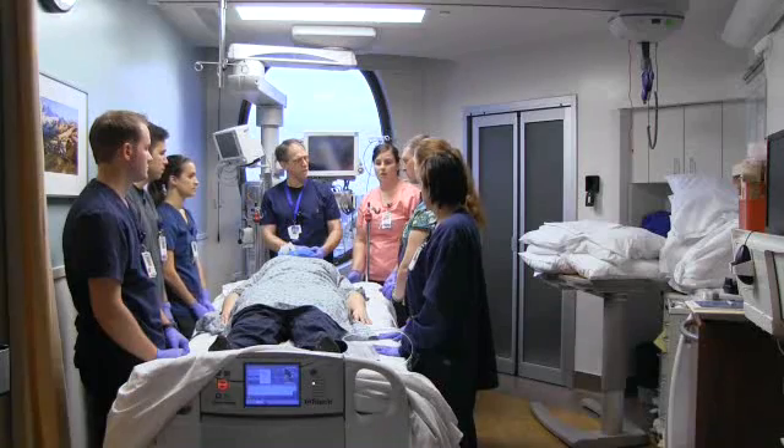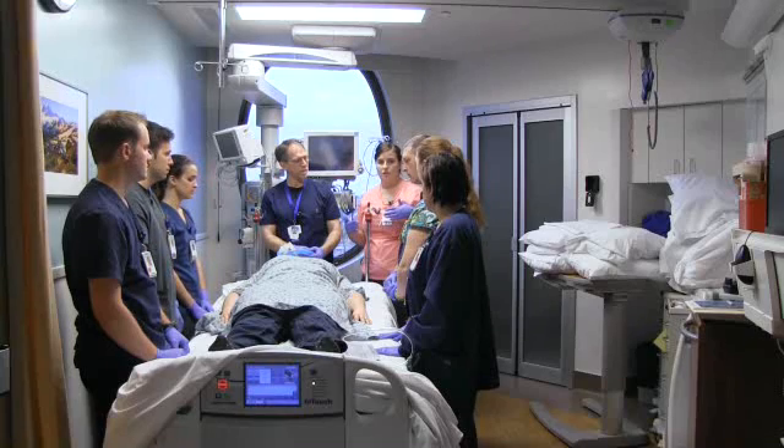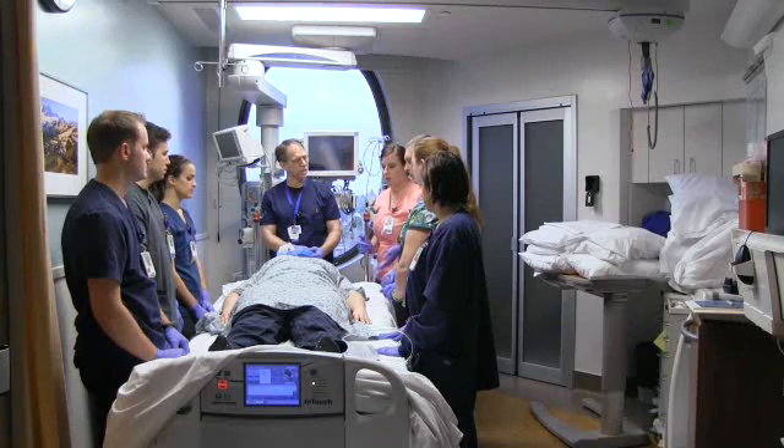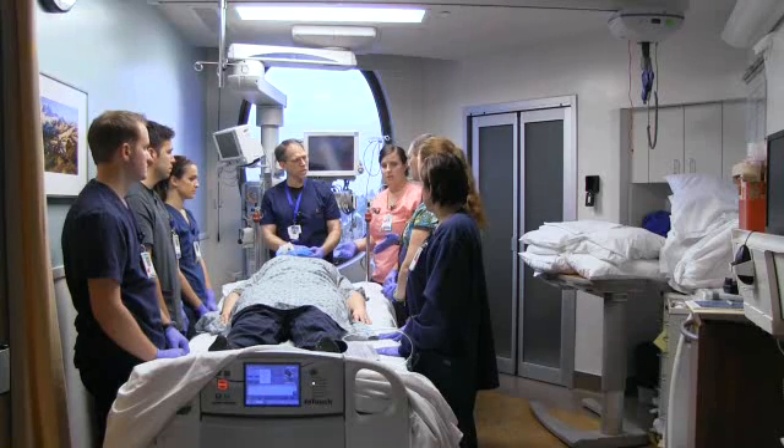The big thing is to make sure the patient doesn't have any gown on at the time. You'll leave your EKG stickers on while you're doing the prep work, but start to remove any unnecessary tubes. Disconnect your tube feed from your Dobhoff tube. Make sure that your A-line and everything is ready to be disconnected when you're ready to go, and remove anything that's not necessary.